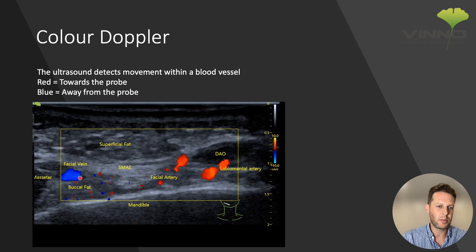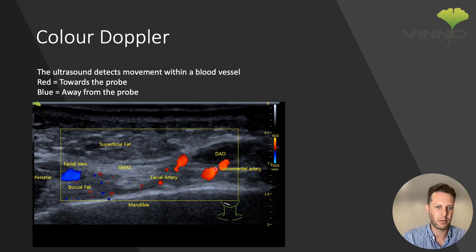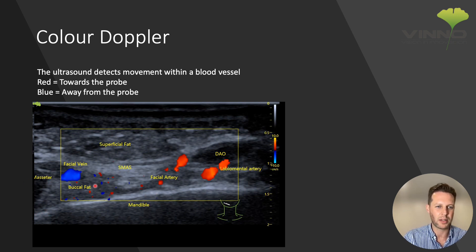Looking at this next image, we've got the facial vein, which just happens to be blue on this image, and the facial artery, and we've also got the labiomental artery — so we're in the lower part of the face. You can see the position of the probe. We've got a cross section or short axis of the DAO, some superficial fat, the SMAS which is connective tissue shown as this bright white line, and then deep to this we've got the mandible, the masseter on the left, and the deep fat under the facial vein.